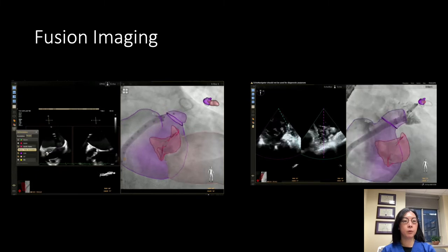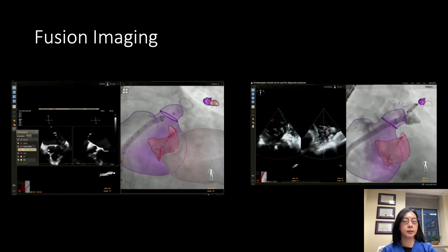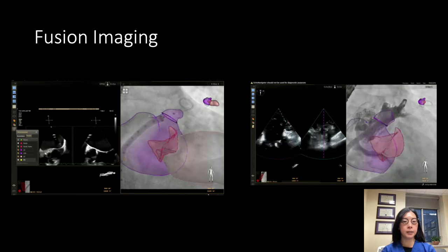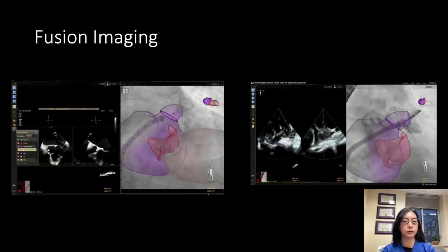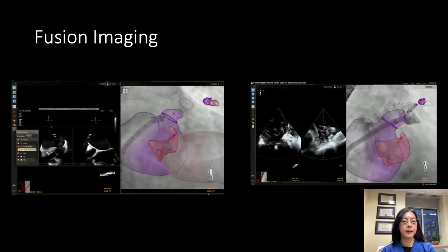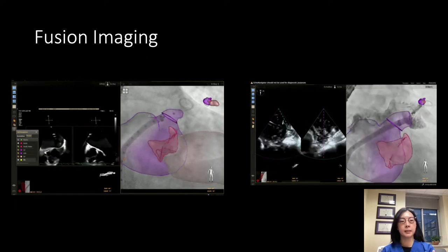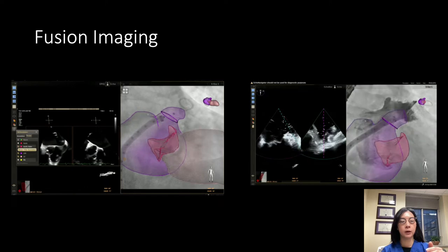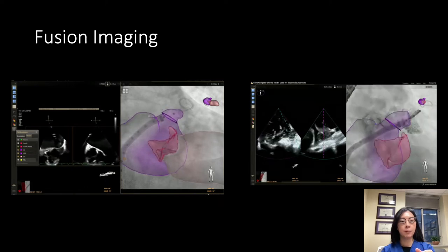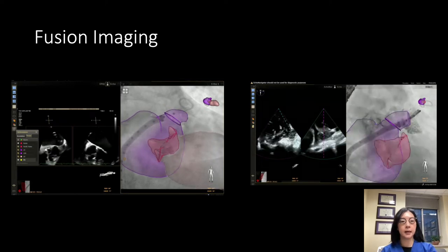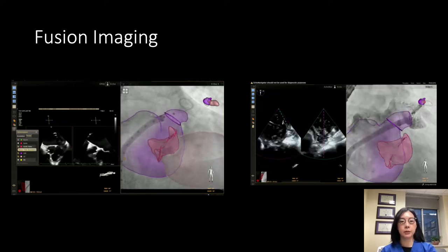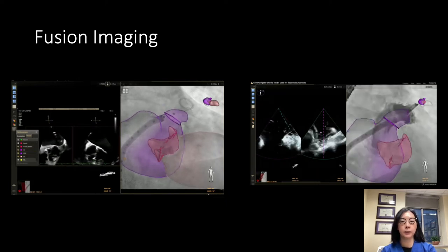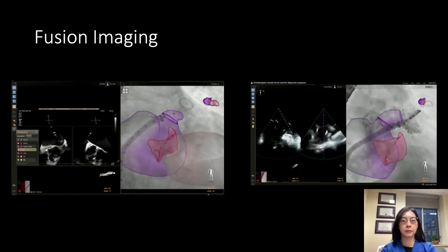Here's an example from our own lab of fusion imaging for a left atrial appendage closure device. We created a model of the left side of the heart using TEE data — the left ventricle, mitral valve, left atrium, and left atrial appendage are all traced out. The left atrial appendage is a little truncated because the data set couldn't capture all of it, so the catheter appears to go beyond it. On the right image, we have the catheter in, injecting dye into the appendage, with the orifice marked and the ventricular structure removed for clarity.